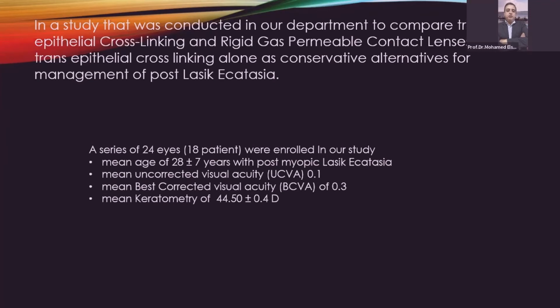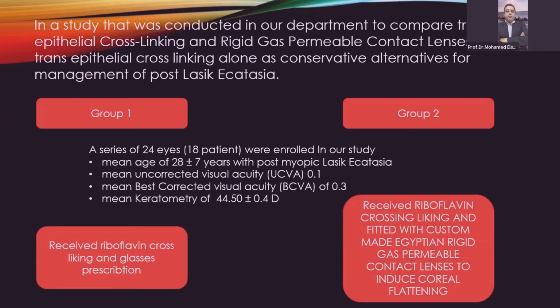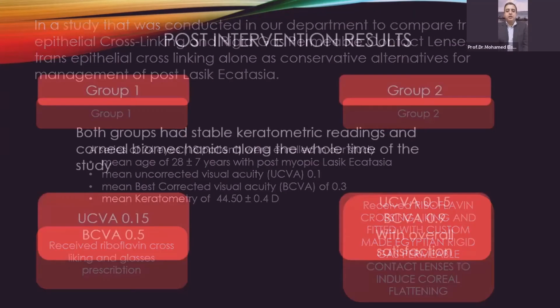We selected 24 eyes, divided into two groups. In one we did cross-linking and correction of the error with glasses. The second group had cross-linking and correction of the error with RGPs, the Egyptian RGPs.